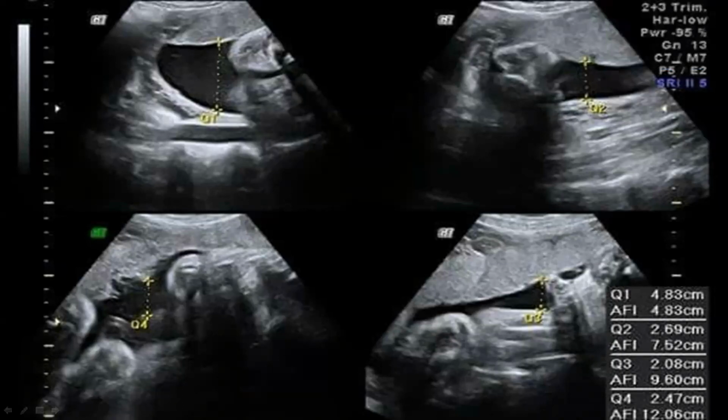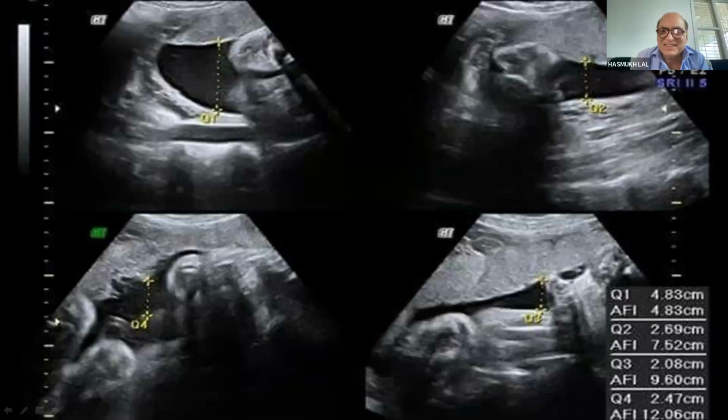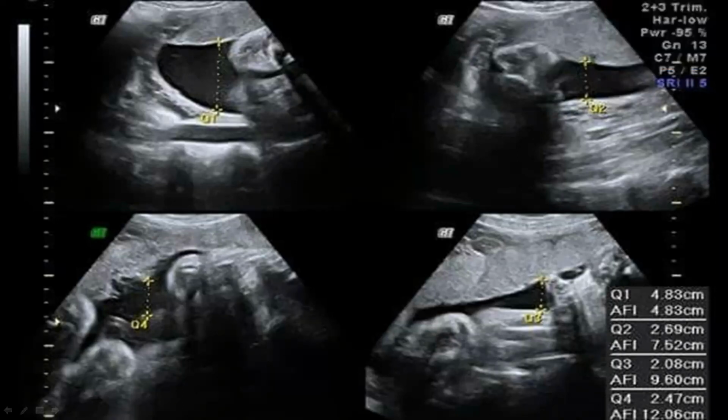I am reminded, when we went for Suresh's training, his assistant told us that if you don't get the BPD, you go for the spino-occipital angle. From there, you give a round sweep and you come to the BPD plane. Remember, because they used to teach us like that. We were taught to go to the neck, see the posterior part of the neck first, and rotate 90 degrees. He had a nice book also published on how to manipulate the probe. I will go to Ashok sir's training. I learned a lot of things.